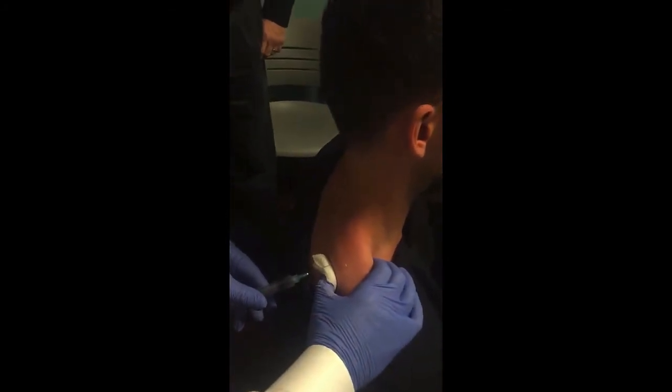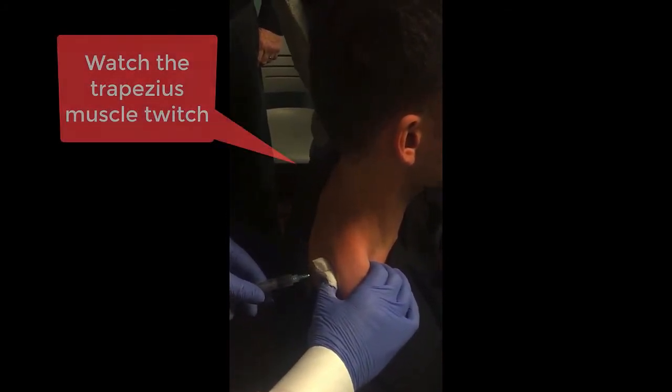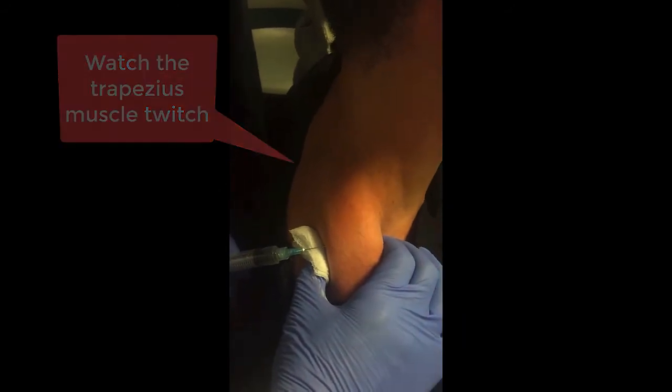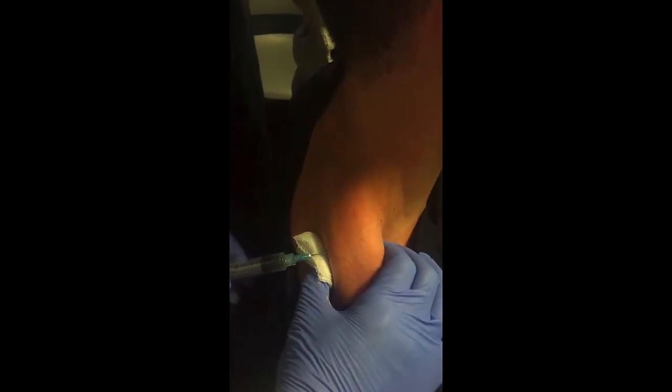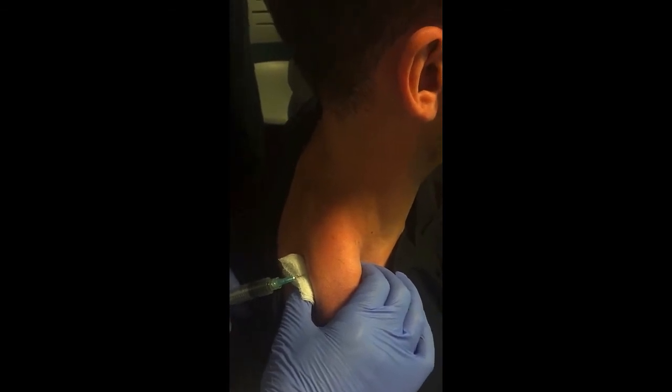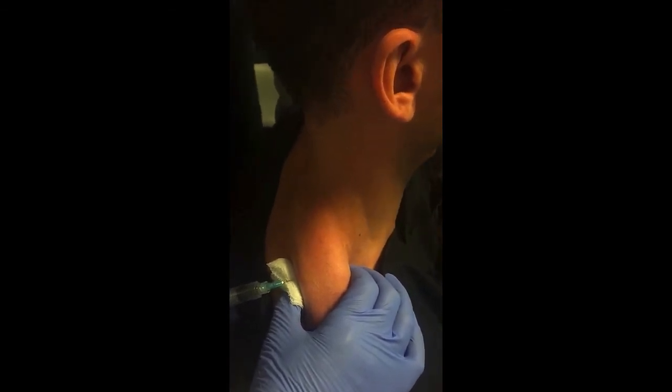I'm going to poke. So I'm 100% in muscle right now — did you see that twitch? That's a twitch response. I love getting that on film. That's awesome. So you can see I'm in muscle, right?